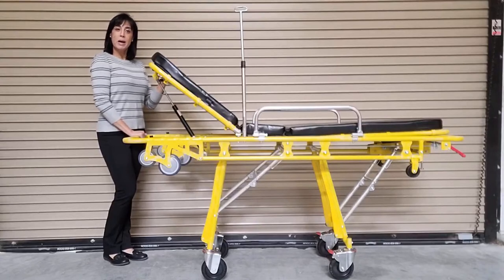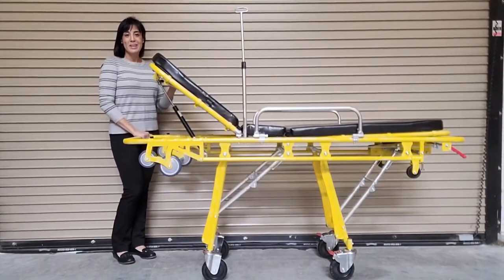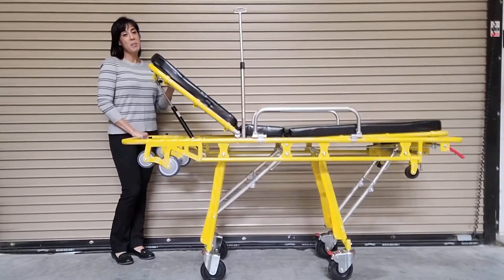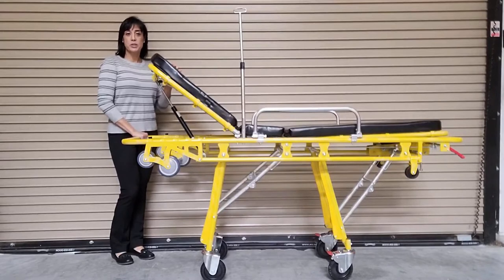This stretcher is made from aluminum alloy and has a weight capacity of 400 pounds. The MS-3C-200C has a maximum vehicle loading height of 27 inches. In its full upright position, it is 37 inches to the top of the pad. In its full collapsed position, it's 13 inches to the top of the pad.